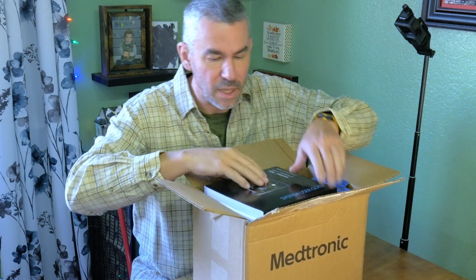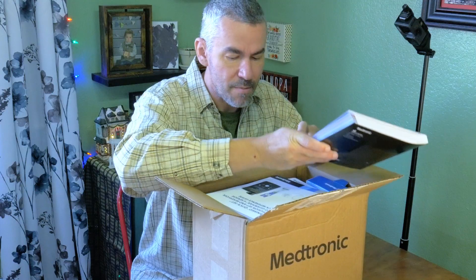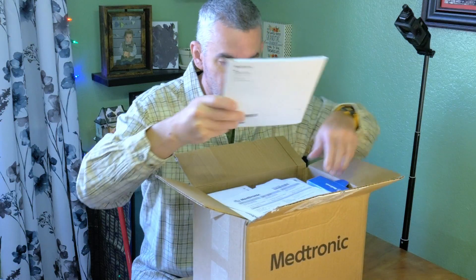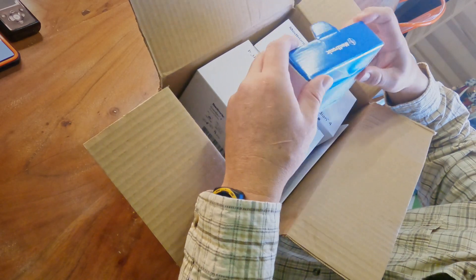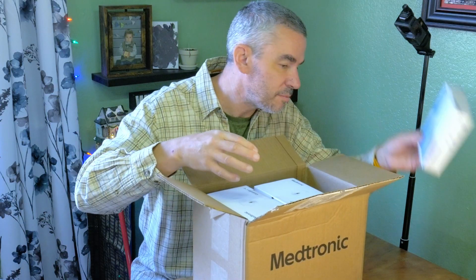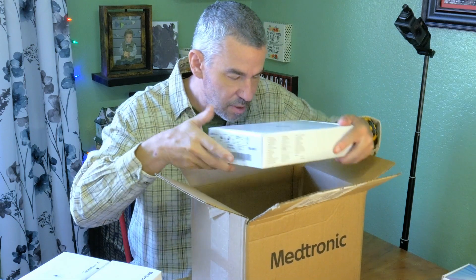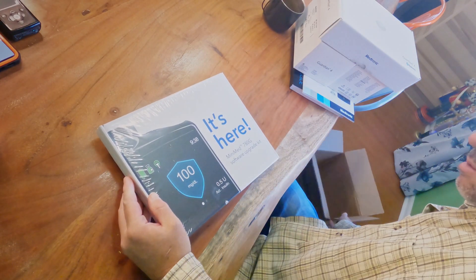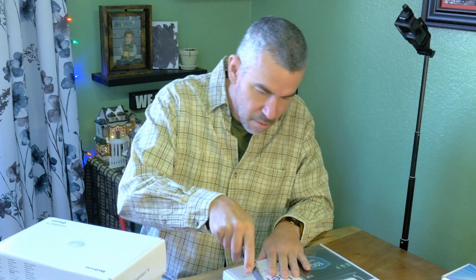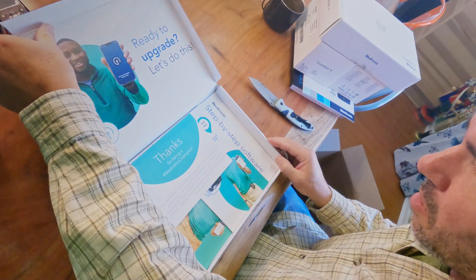What you get is a new manual for the 780G with the Guardian 4, a quick reference guide, documentation that you don't need to read, a RMA box so you can send the pump back if you brick it, and the Guardian 4 sensors. The Guardian 4 transmitter for the upgrade kit — it is important!